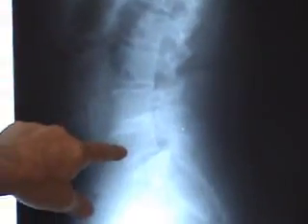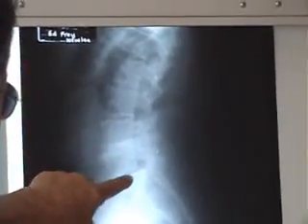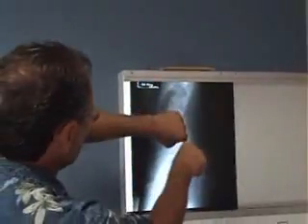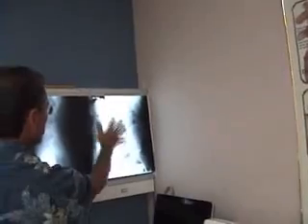You have the spondylolisthesis, that is, this is moving forward of that. And you had the disc space here was very limited. And here, you're seeing the bottom of this and the top of that, and they're close together, but it's hard to tell how close because you have that kind of effect happening as well. And here's the front view.